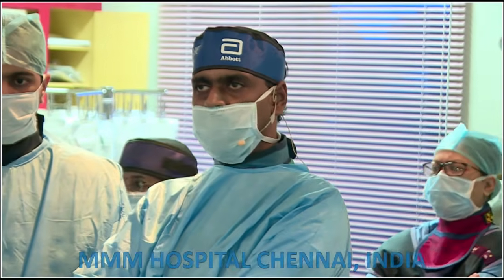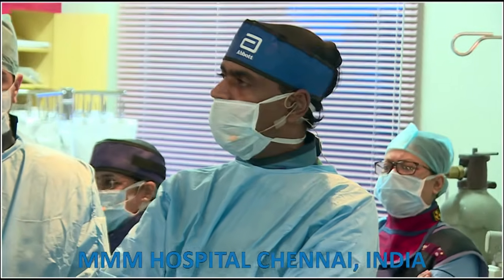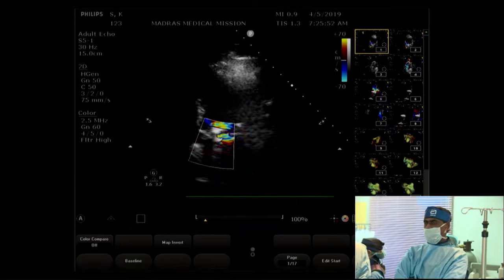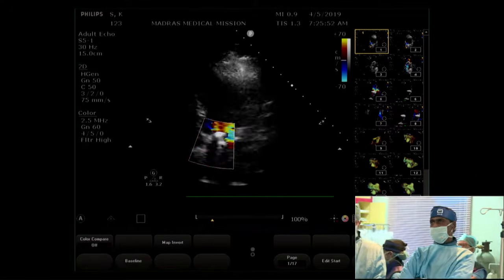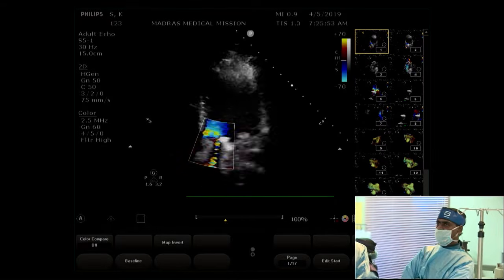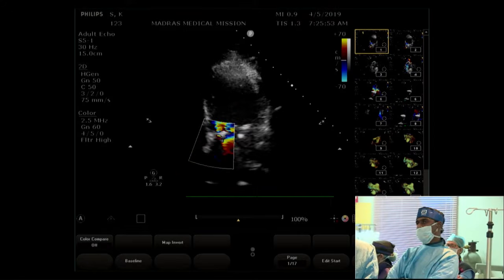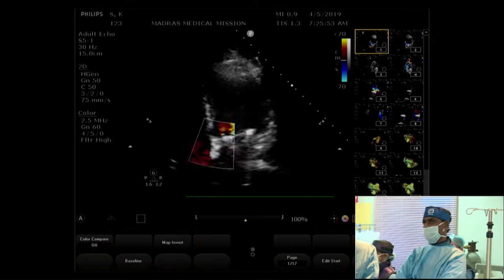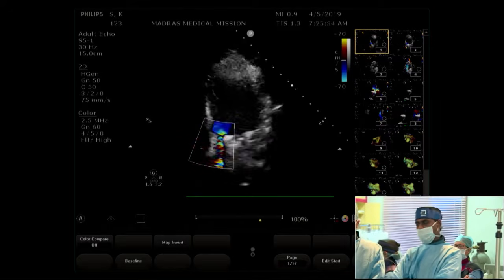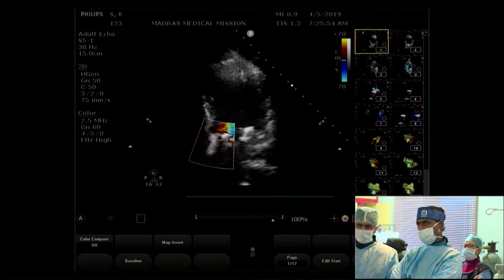Dr. Rajesh, I think you heard the story of the patient. Yes, we have looked at the presentation and we have heard that. So my colleague Dr. Srija is going to briefly show. The plan is, this is a lady who is freshly operated within the last 1 year and has a significant paravalvular leak with some evidence of hemolytic anemia, and the size of the leak was almost close to 10 millimeters, and so it is planned for closure.